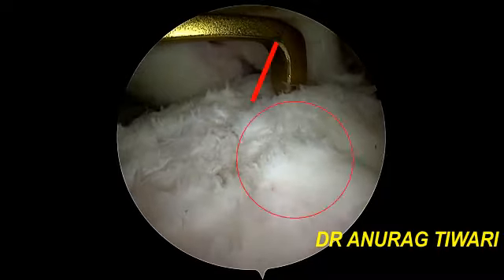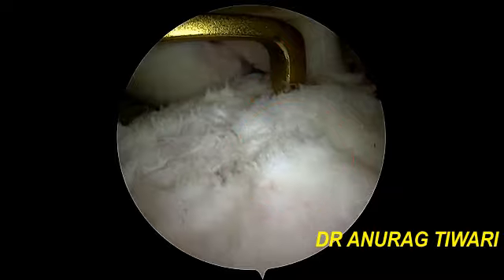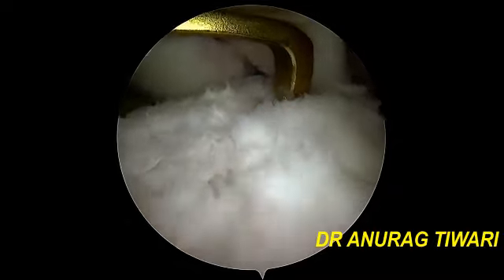So this will be the projected trajectory of the guide wire, and you can see here the red marked circle is the anterior horn of the lateral meniscus. So I am sure that this position is adequate. So I will ream while inserting the guide wire, while fixing this jig at this appropriate position.